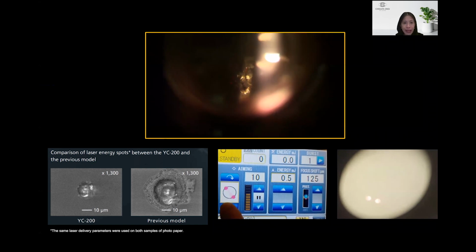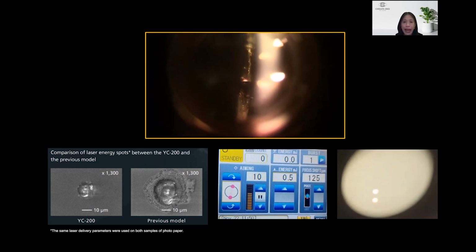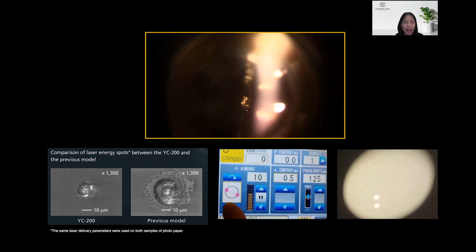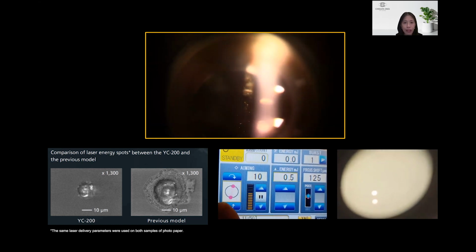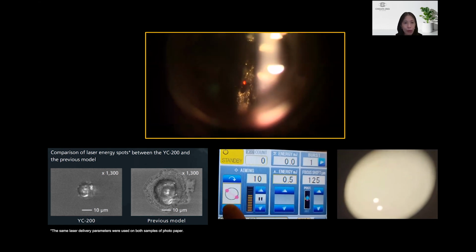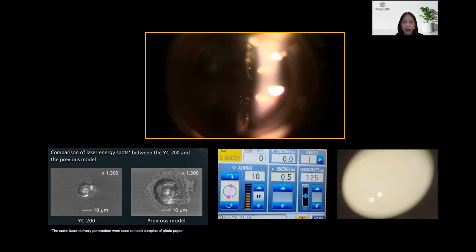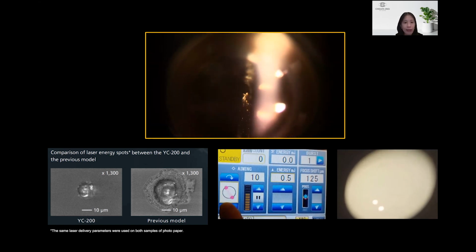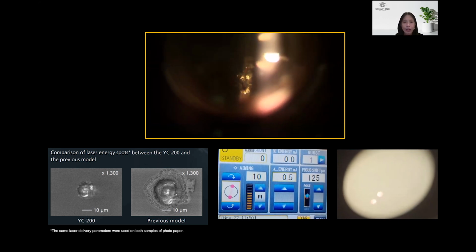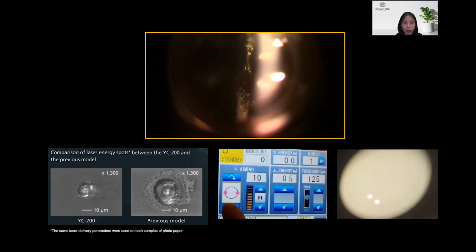The laser machine I have in my clinic is the NIDEK YC 200S+, and I'm going to digress a little from SLT and share a bit about the YAG function of this machine. I really like performing YAG capsulotomy with this machine because it has a low plasma threshold, which means that the energy is delivered very precisely and I found that it was less likely to cause IOL pitting compared to some of the other YAG machines I have used.